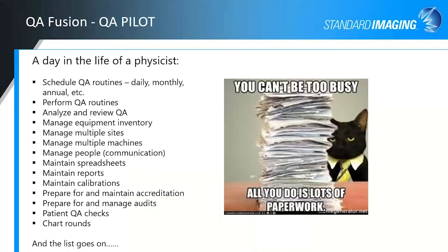So let's get into what we're here to actually talk about today, which is just how incredibly stressed, busy, even overwhelmed physicists can be given the tasks that you are all assigned to do, whether that be performing the QA, reviewing the QA, managing people and sites, preparing and working with auditors and regulators to make sure that everything is running smoothly and in accordance with those regulations. The list just goes on and on.